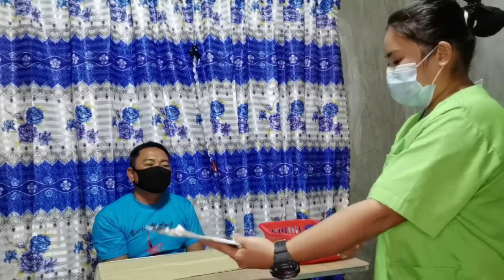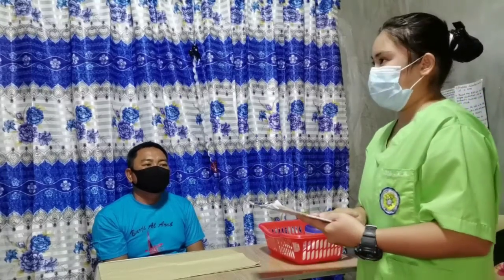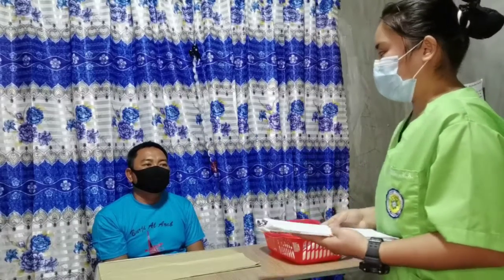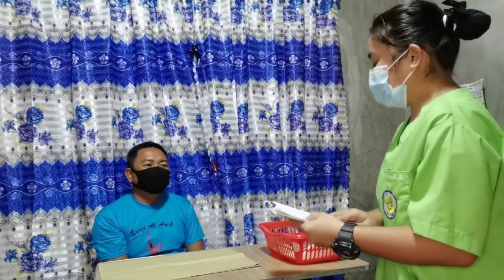Complete necessary assessments before administering medications. Check the allergy bracelet or ask the patient about allergies. Explain the purpose of the medication to the patient. Perform hand hygiene and put on clean gloves.